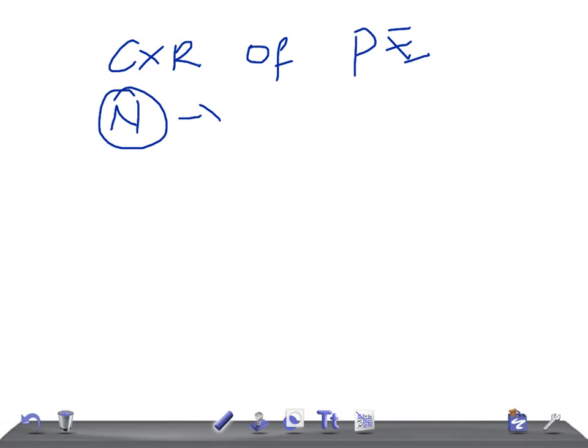So let's talk about the chest x-ray findings of pulmonary embolism. The first is what you call Westermark sign.